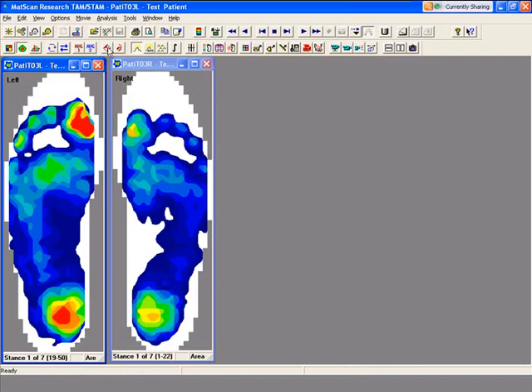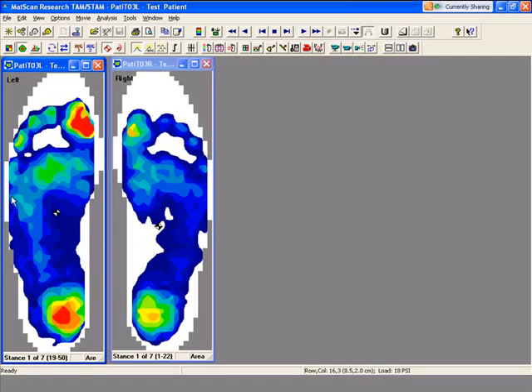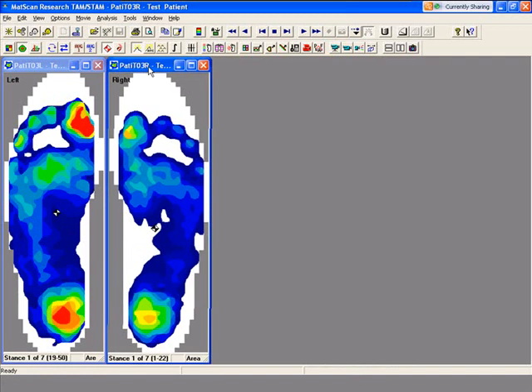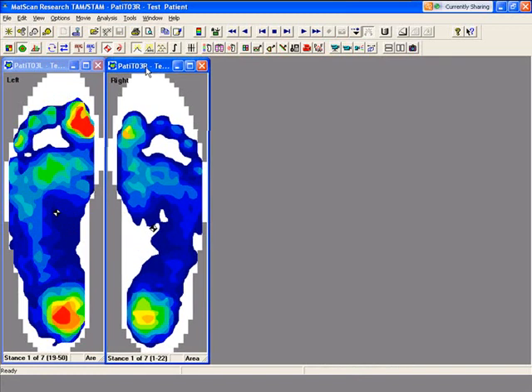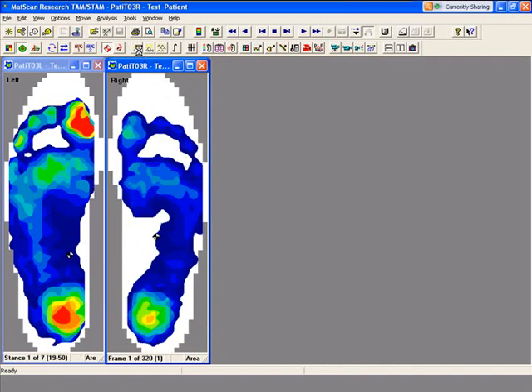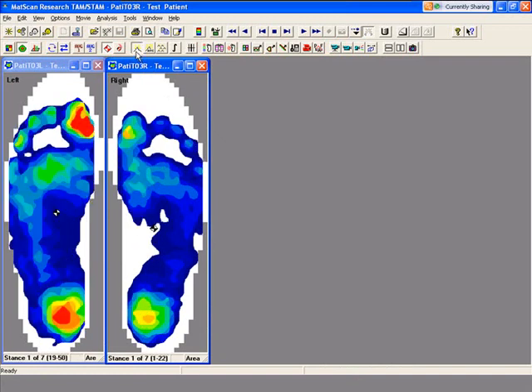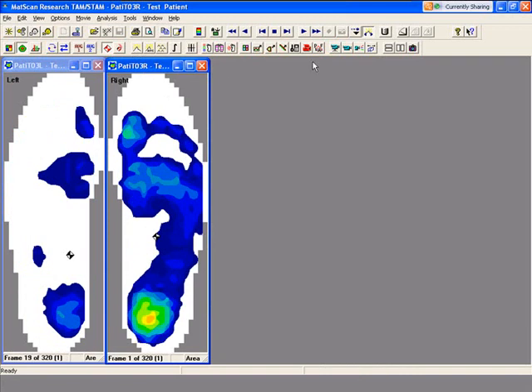Next we're going to look at the center of force and the center of force trajectory lines. What the center of force does is show you basically the balancing points. Right now we're in what we call peak mode, so it's showing you the average center of force for this whole foot strike. What you look for is to see how well they match up, if they're in the same location.